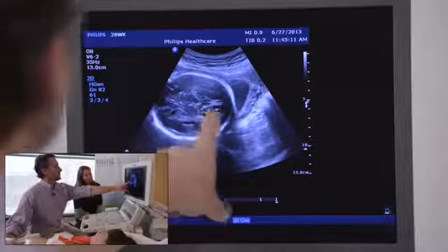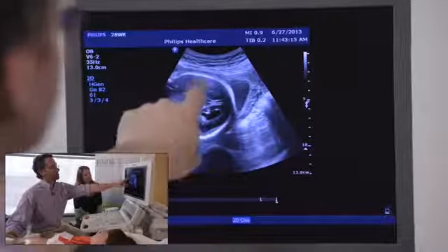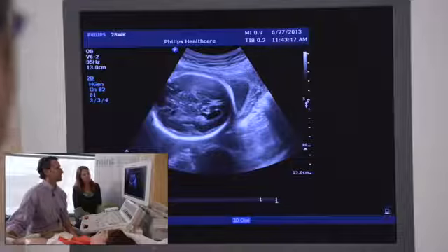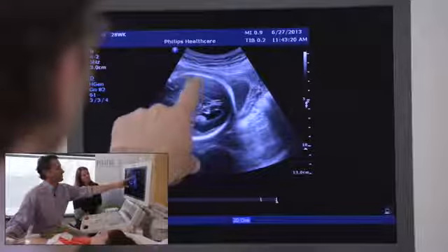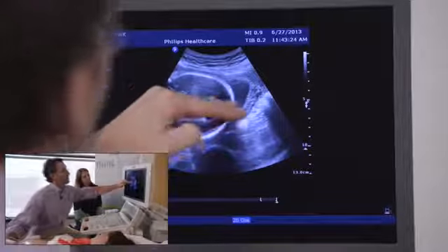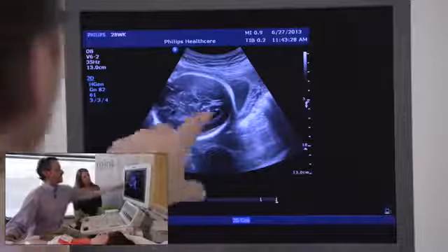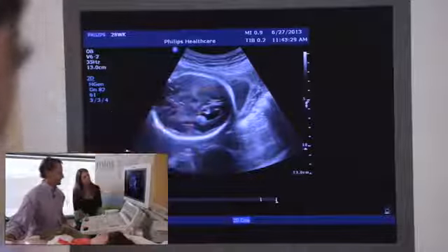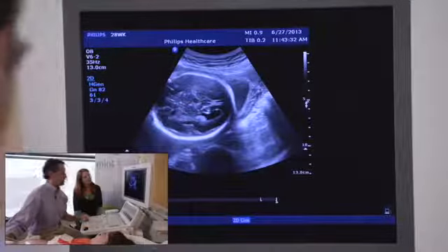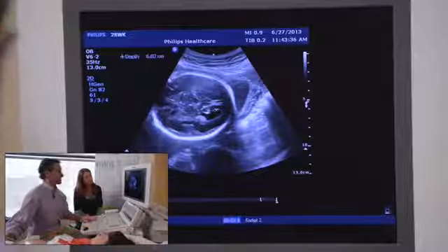If you notice here, we see this ventricle perfectly. However, up here, there's another ventricle sitting right there, and you see nothing. That is what Michelle referred to as reverberation artifact coming off the skull. So it basically makes everything up there invisible. If you were actually to see that up there, you would get concerned that the bone was abnormal. And we do see that sometimes with some of the more unusual skeletal dysplasias.